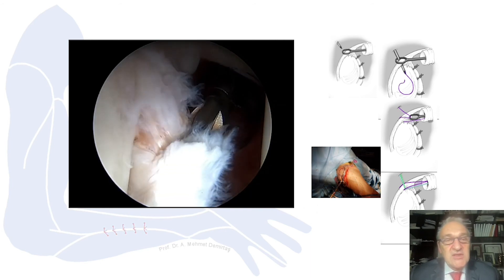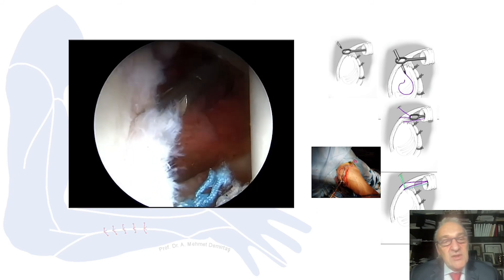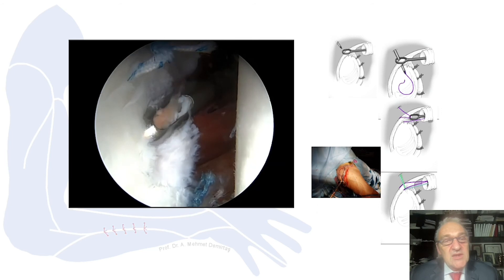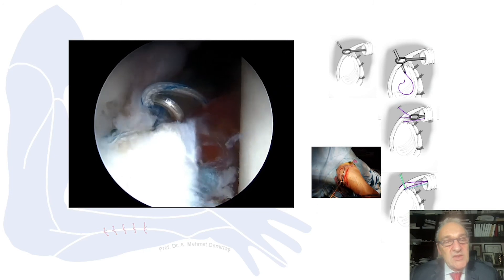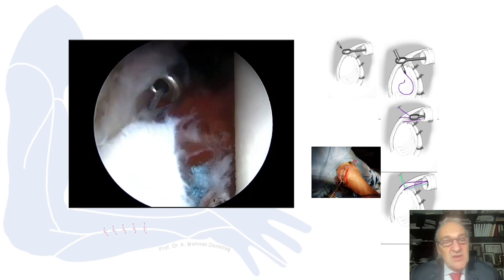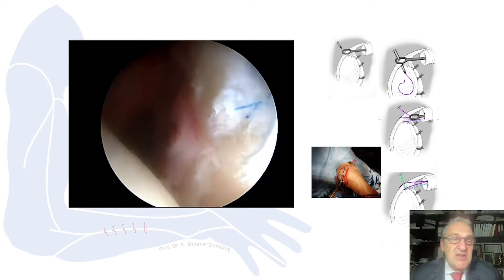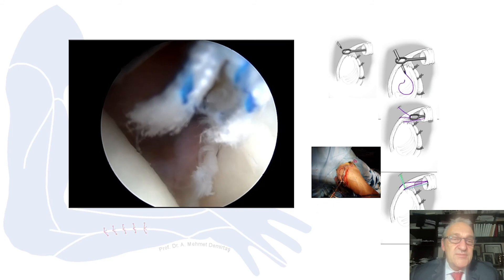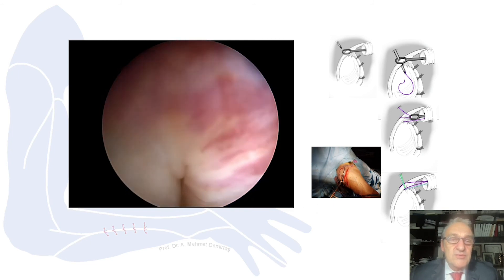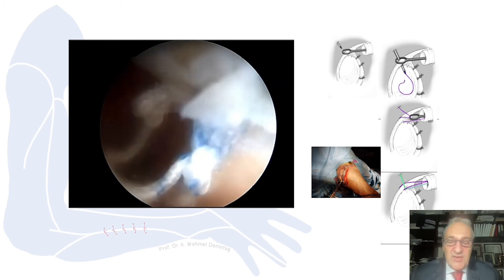Now I change the camera and check the rest of the repair. This is the subscapularis and upper part. I decided to make another anchor and repaired that area as well, using only one suture since two are not needed here. I change cameras, check the repair with a probe, and check the humeral side — and it is finished.